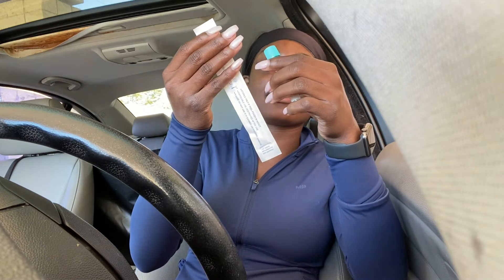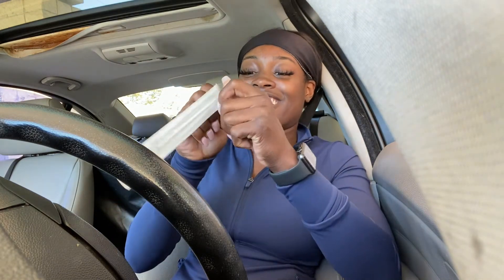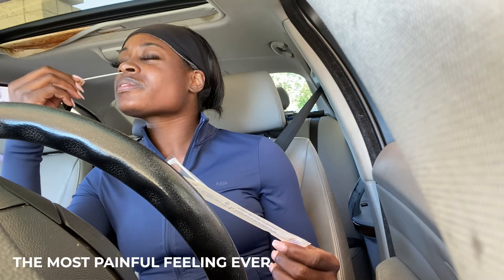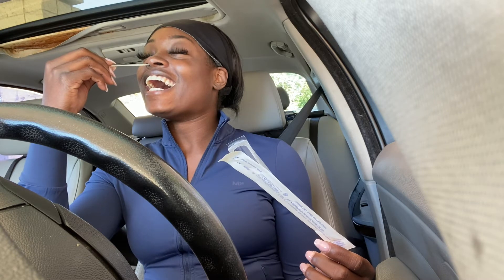And then how do I break it off? So basically you're going to put it in the vial and then lift it up and just kind of — okay, alright. Let me put this down, it's too much. Pull it out. Okay, stick it in my nose. Let's see. Oh! Okay, is it 15 seconds yet? Okay, I think that's 15 seconds.